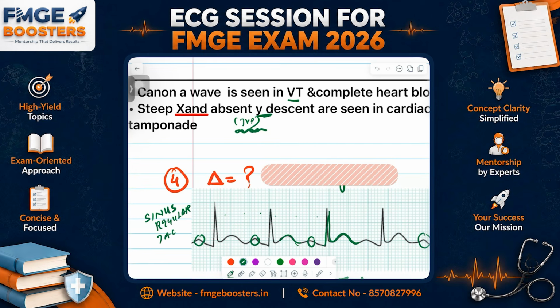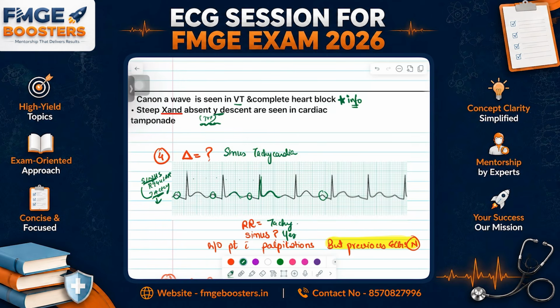It is tachy. Now tell me, sinus plus tachy gives what? It is sinus tachycardia. Clear everyone? Just three things again I'm repeating. If you know those three things, you will remember the ECG always.